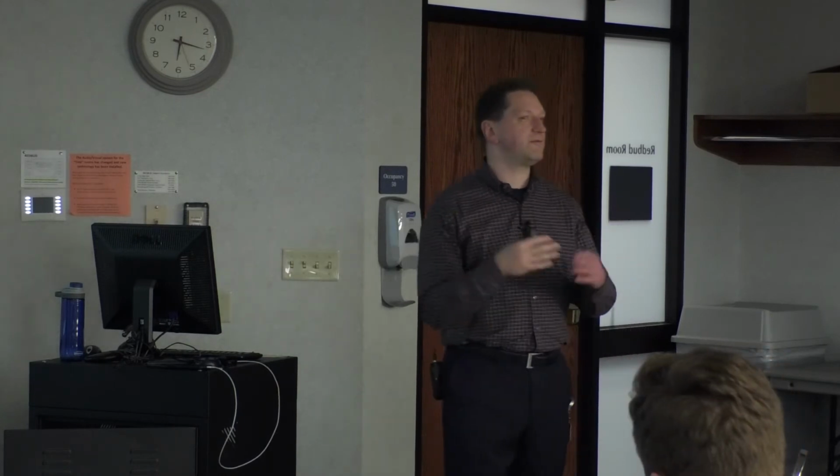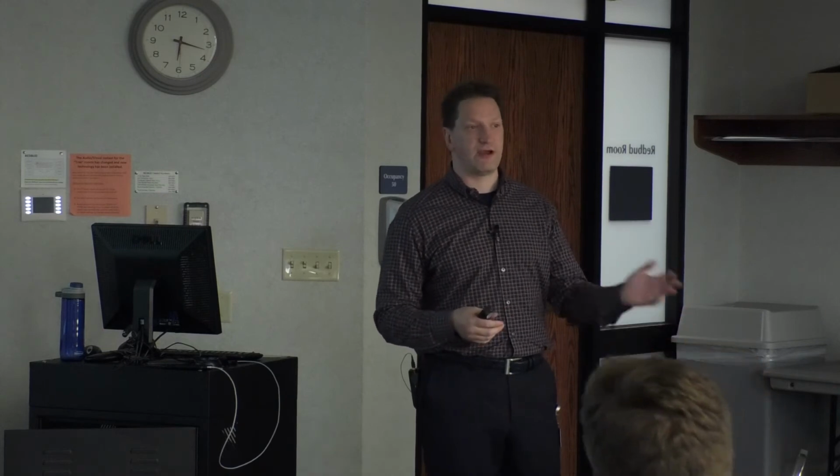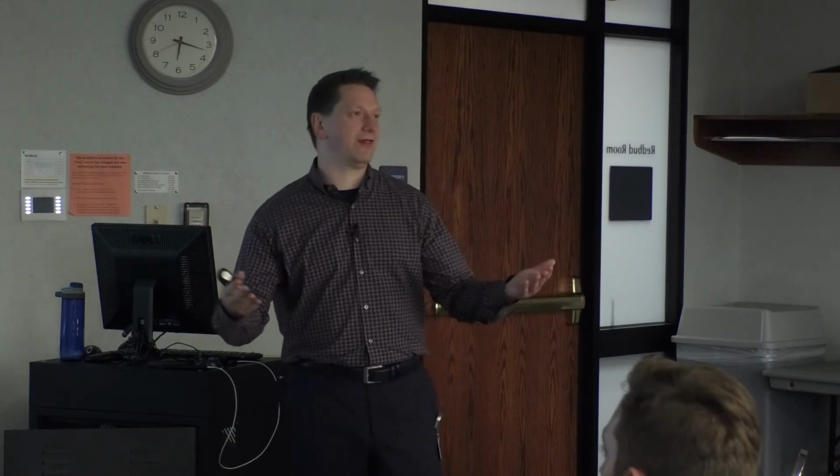myocardial infarction. Anytime you have more than one territory, it should never be more than 2 territories. You just name the territories that go together. So if it was V3, V4, V5, and V6 that had the ST elevation, what would the name be? Anterolateral MI. There you go. You got it. If it's 2, 3, and AVF and V5 and V6, what's the name of that heart attack? Inferolateral. You got it. See, it's just that easy. You guys are already pros.